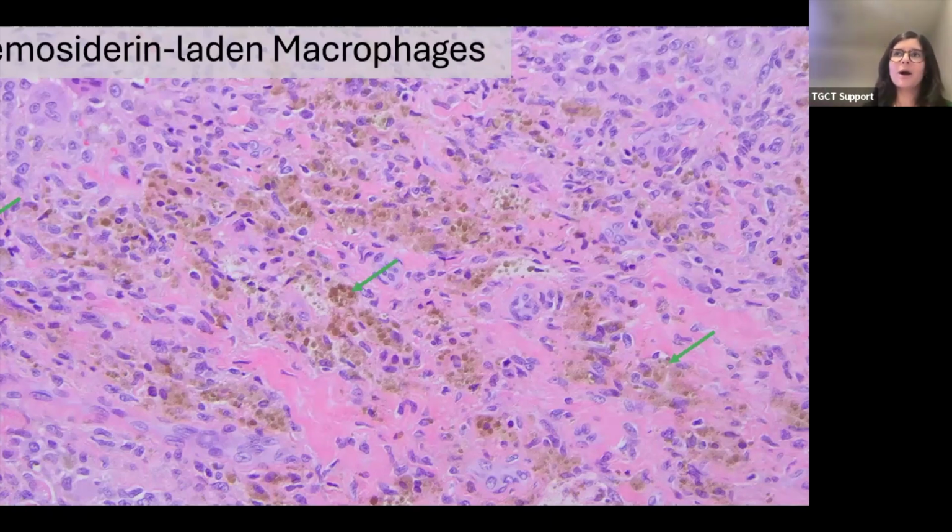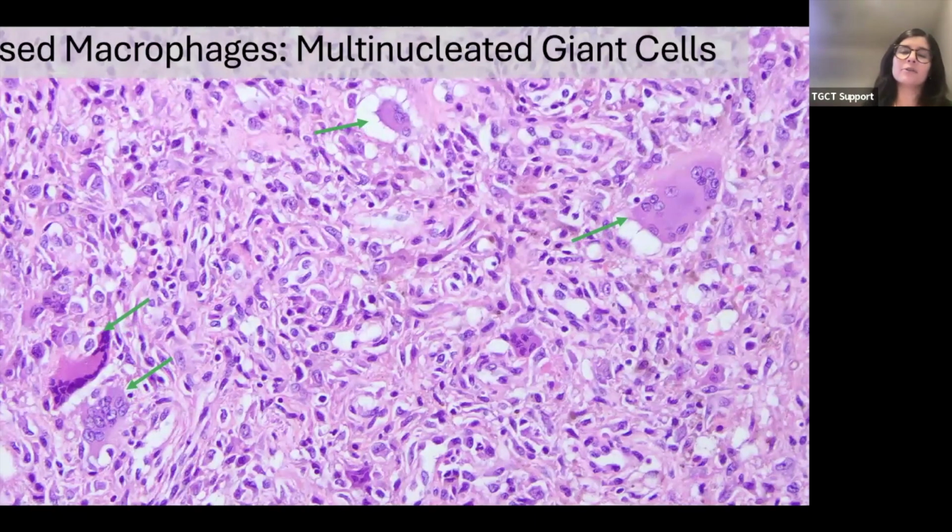And then, of course, you're like, why have you not talked about giant cells yet? Well, giant cells are really just fused macrophages. And we call them giant cells because they're obviously very, very enlarged to accommodate the numerous nuclei that they have. So this is one that's a little bit degenerative, but again, you can see the many, many nuclei within one giant cell. And this comes from the macrophages themselves fusing. And so essentially it's still the same macrophages that are recruited, but again, macrophages within the tumor can look very, very different.